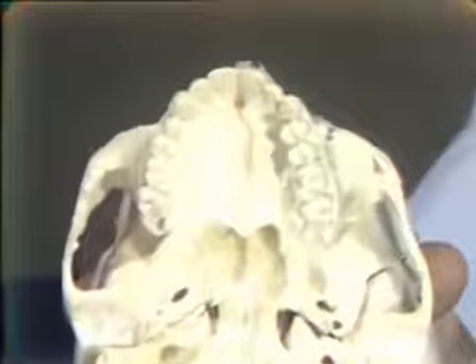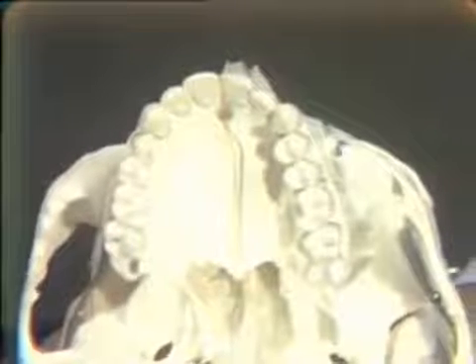We're going to demonstrate on the skull the anterior palatine injection, which anesthetizes the anterior palatine nerve as it leaves the anterior palatine foramen and sweeps forward to approximately the cuspid area on the same side. This again will anesthetize all of these tissues, soft tissues, from third molar to cuspid. We wish to avoid anesthetizing the middle and posterior palatine nerve, since this gives a sensation of fullness to the lateral palate and lateral pharynx, and it creates a situation in which it seems difficult for the patient to swallow.